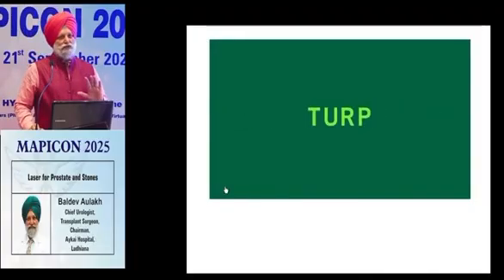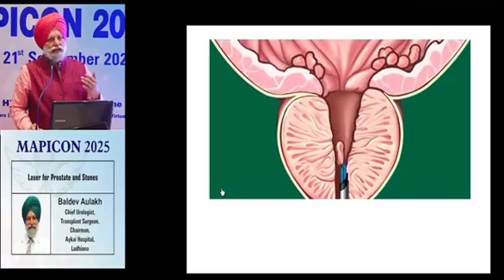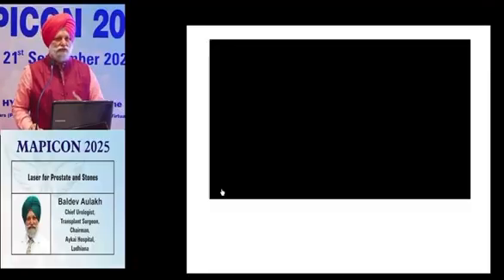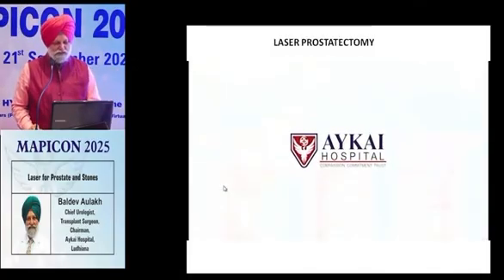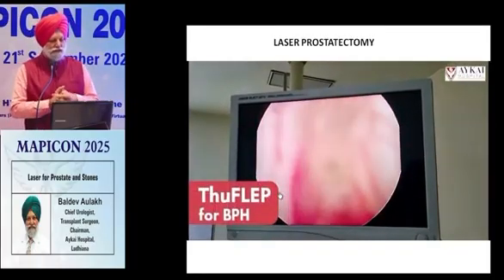So this is the gold standard, where we remove the prostatic tissue with the help of unipolar or bipolar cautery. Bipolar gives you the advantage that you can use saline only and the patient doesn't get fluid overload syndrome or something like that, which I have never seen in my life. We keep on reading about it in the books only. But people say there can be bleeding in transurethral resection of the prostate, or the patient is taking some anticoagulant, so the patient is comorbid. Then the technology has come that we must use lasers for these patients. This is the high-powered thulium fiber laser.